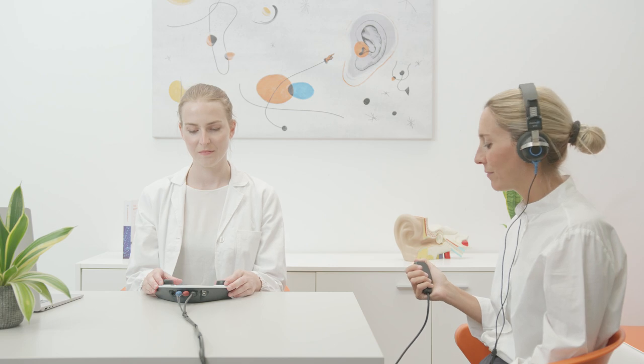Triangle is available either with RadioEar DD45 supraoral headphones or RadioEar DD65 circumoral headphones for better isolation from outside noise.